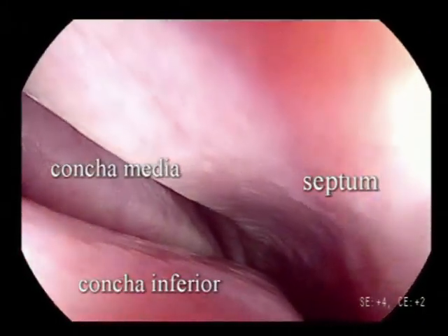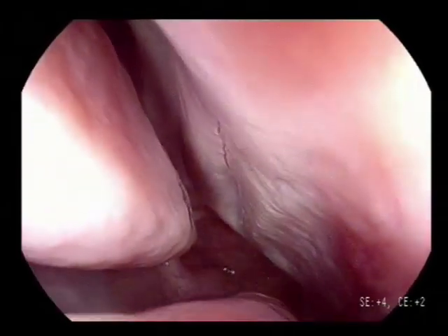When entering the nasal cavity, always make sure to follow the open lumen. When you see white sides on your endoscopic image, this means you are touching nasal structures, which can be uncomfortable for the patient.